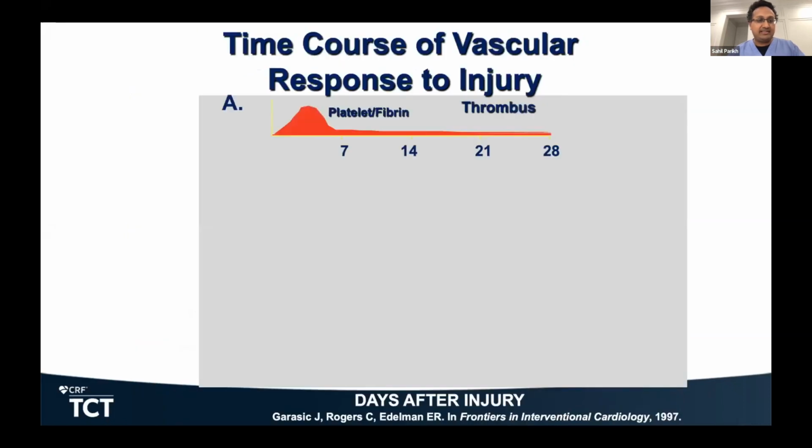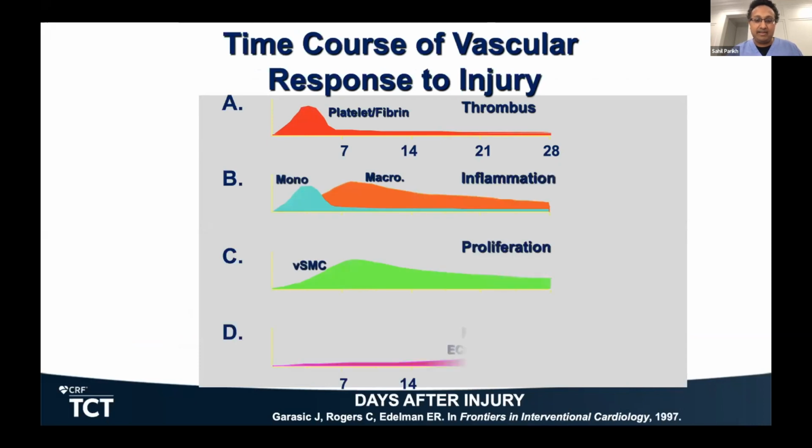But I think I'd like to sort of bring it back to clinical reality, and make a few key points that are germane, not just for drug-coated balloons, but all vascular drug delivery. So it starts by understanding that the vascular response to mechanical injury specifically is quite stereotypical and consists of thrombotic, inflammatory, and proliferative phases, followed by extracellular matrix elaboration and remodeling.